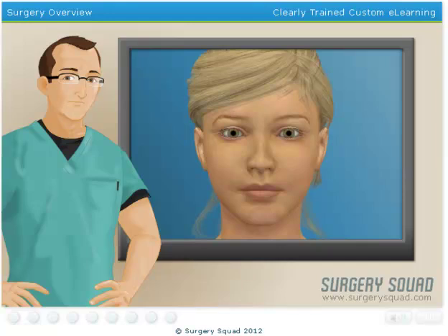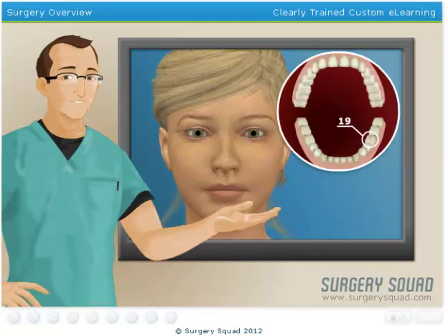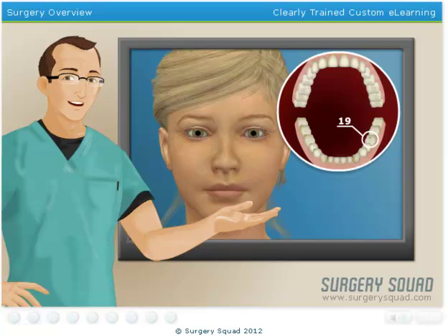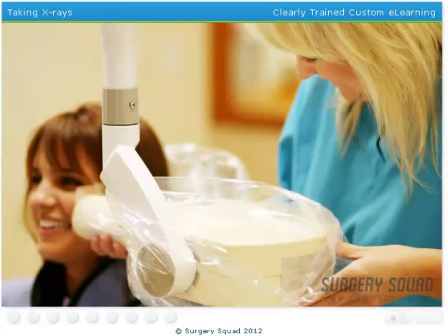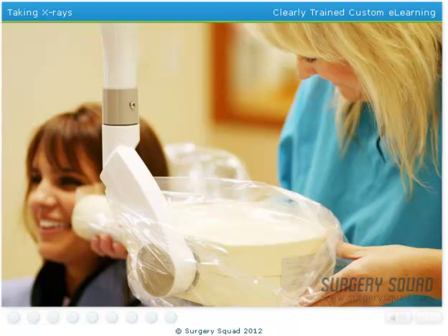Our patient today has been experiencing some slight discomfort in their lower left first molar, or, as dental professionals might say, tooth 19. Before we begin, we need to get some x-rays taken of our patient's teeth. X-rays, or radiographs, are essential, low-cost diagnostic tools used to examine a tooth's roots, check the health of the bone surrounding the tooth, observe the status of developing teeth, and find abnormalities such as cavities.